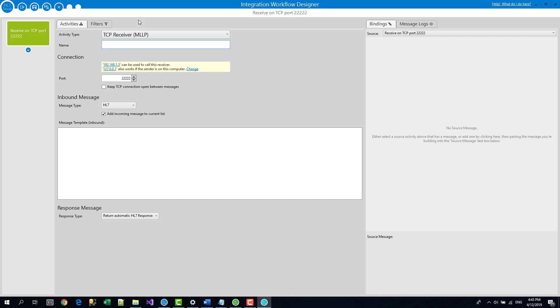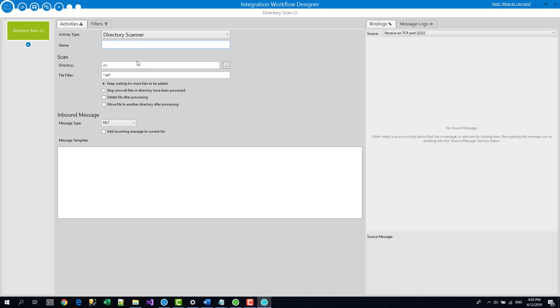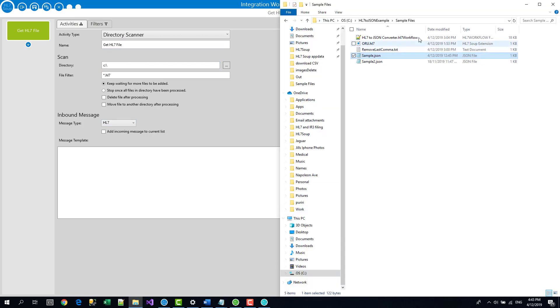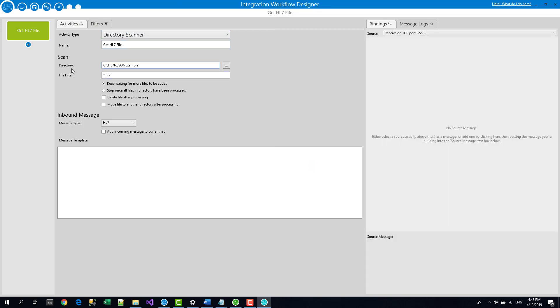So if you recall, we're going to convert from an HL7 file to a JSON file. So we're going to first of all need to pick up that file and I'm going to scan for that file and I'm going to call this step get HL7 file. And I'm going to search in a directory for a file and I'm going to have it in C HL7 to JSON example.